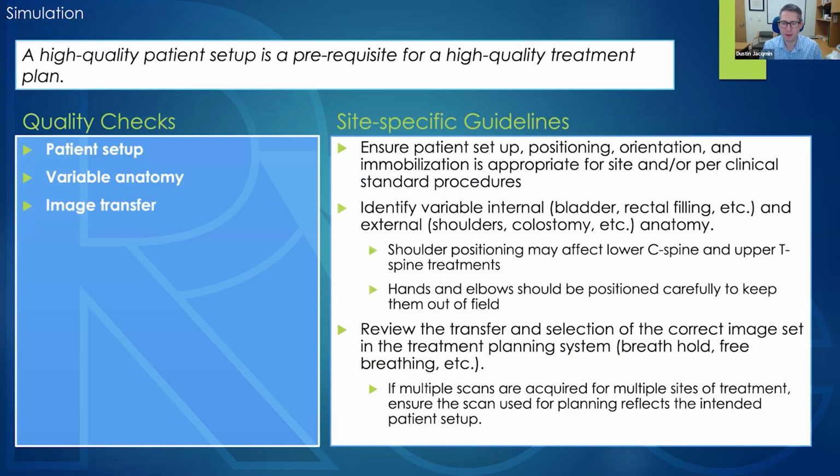So it's good to look at, when the CT simulation therapists or whoever's setting up patients in your clinic took this scan, what were they intending to use it for? Did the dosimetrist match this scan to the right intent? And do we have a plan on the right kind of scan? That is something that can come up when you have lots of treatment sites at the same time.